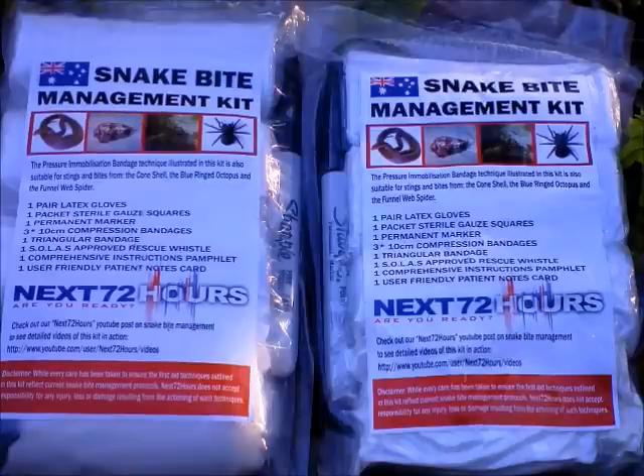Howdy all, Phil here from the Next 72 Hours team, out and about today having a look at the Next 72 Hours Snakebite Management kit which we've put together here.